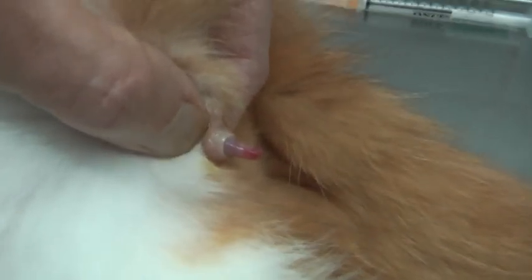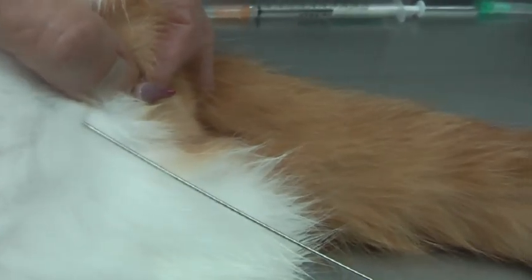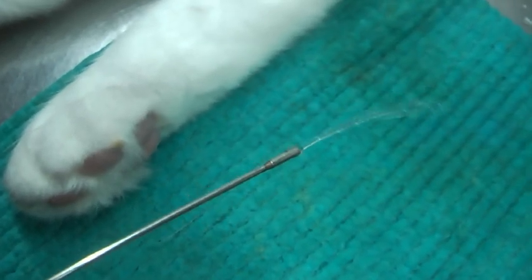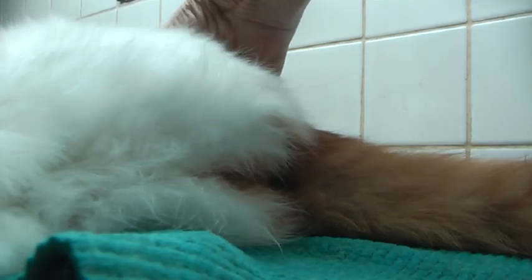The cat cannot pee, so this is what is needed now. Doesn't look so good. There it is — see, not a problem at all. There was something just at the end: small crystals, gone in a second. It's okay.